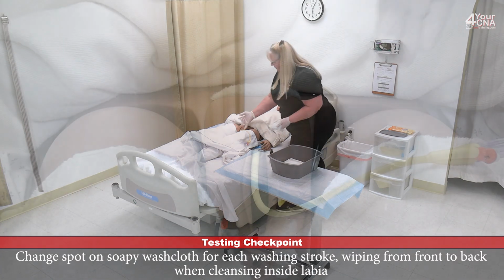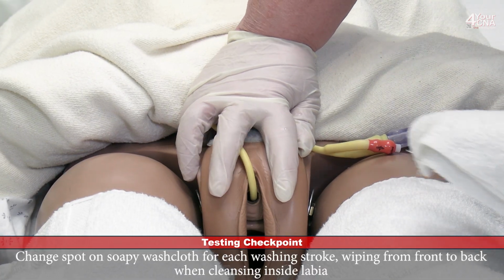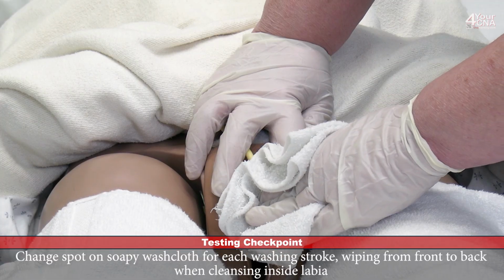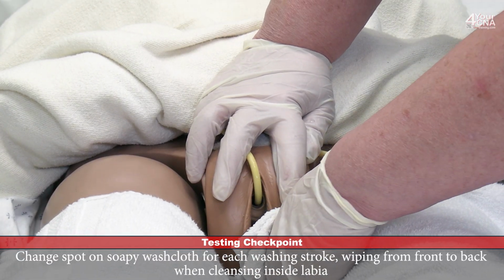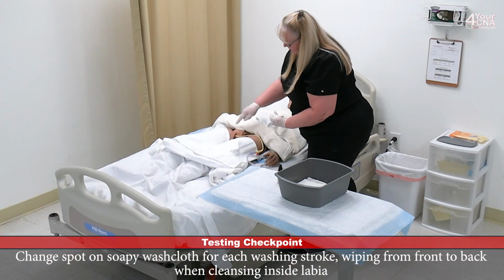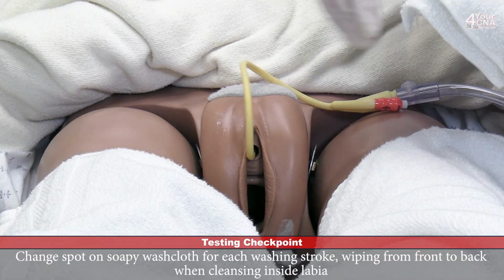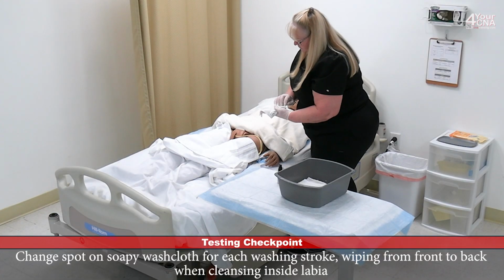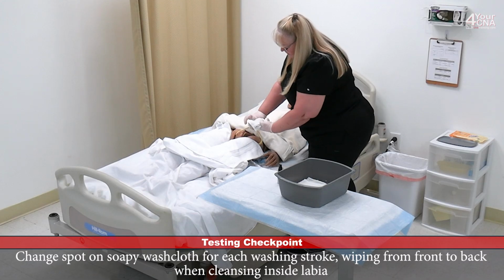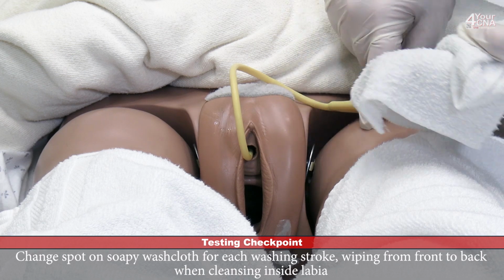I'm going to hold the catheter out of the way, retract her labia, and then wipe down the center, top to bottom, and then move away and fold that leaf. The second leaf will wash the outside of the labia, top to bottom. We'll fold that leaf over. This is going in one direction only, top to bottom. This third leaf is going to wash the other side of the labia, top to bottom.